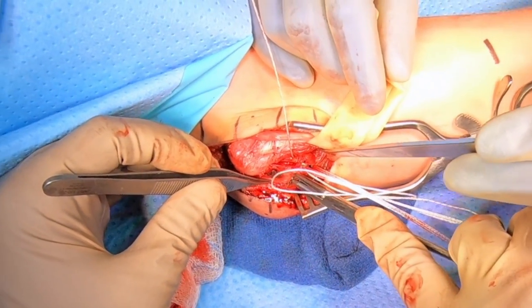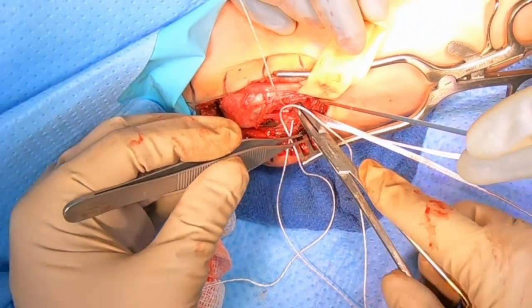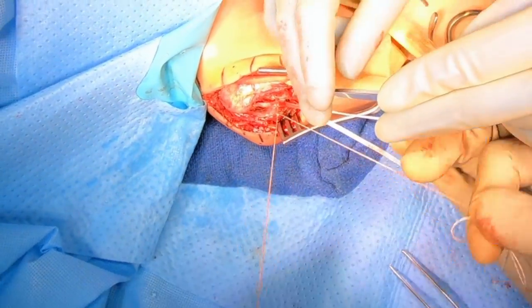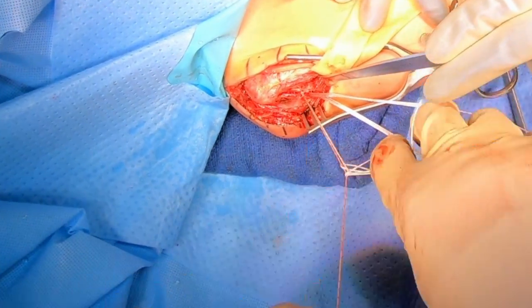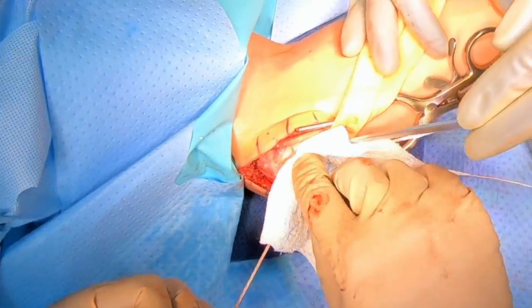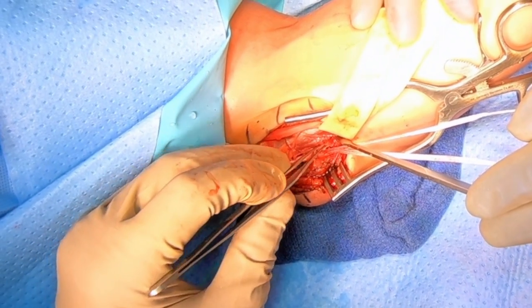We'll do that on both the top and bottom sides of the ligament — again making our second pass to create a loop, then passing the needle back through the loop to create that grasping suture. When I tie this, you'll notice a little bit of blood squirts out from the elbow. Essentially what's happening is when I tie this, it's re-tensioning the ligament, re-tightening the elbow, and making sure that ligament tear is gone. Once that's tied, we've now repaired the ligament. You can see the ligament is taut once again — there's no more of that laxity you saw earlier.